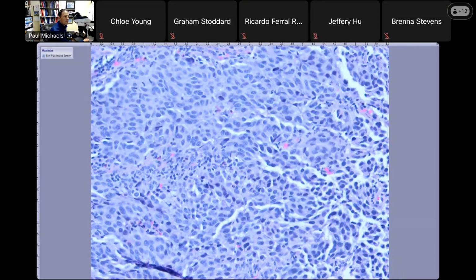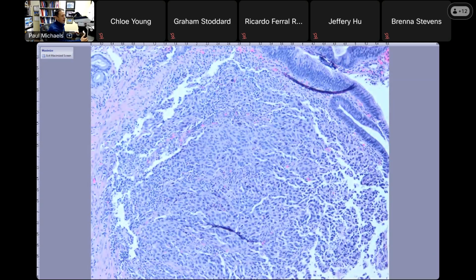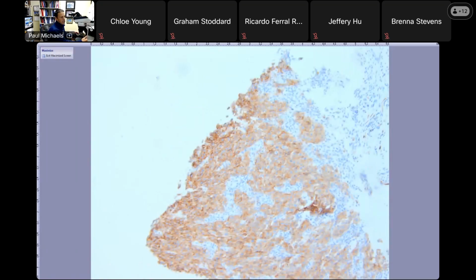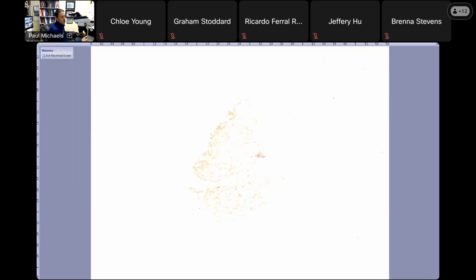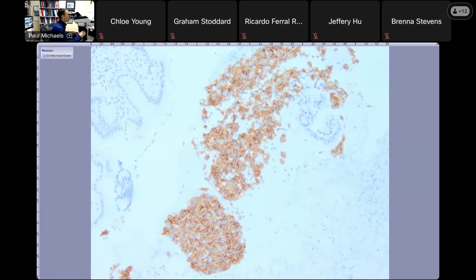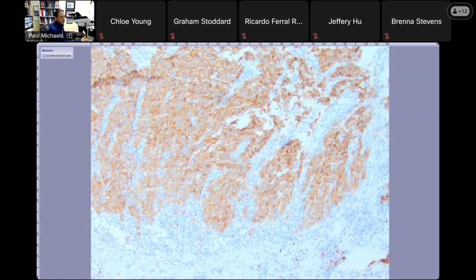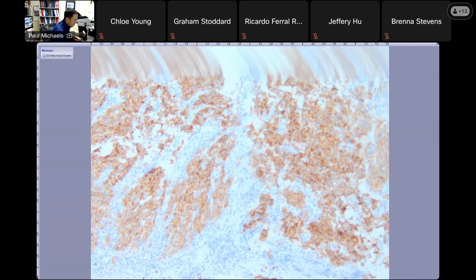This kind of, if this was in the thyroid, you think, oh, it's a medullary carcinoma. So anyway, now this person actually had a history, I told you. But let's say you're thinking it's a GIST. Let's say they don't have a history. This is CD117. This is strongly positive. This isn't just like patchy weak like that CK20 in that lung adenocarcinoma. Every single fragment of the tumor is strongly diffusely positive. So maybe it's a GIST.